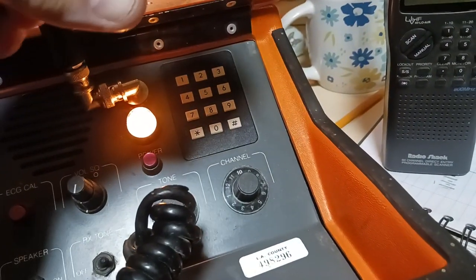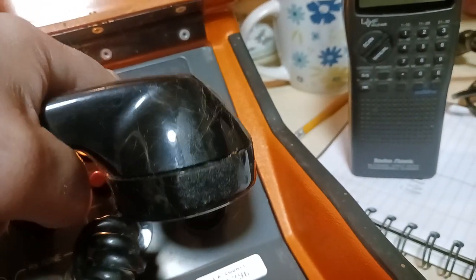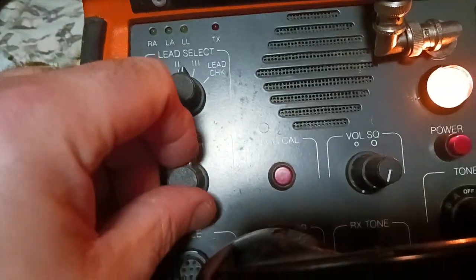DTMF — that works no problem. And finally the lead check function.